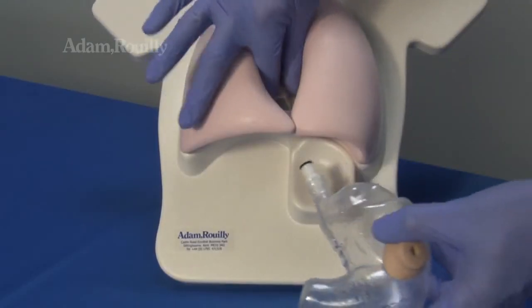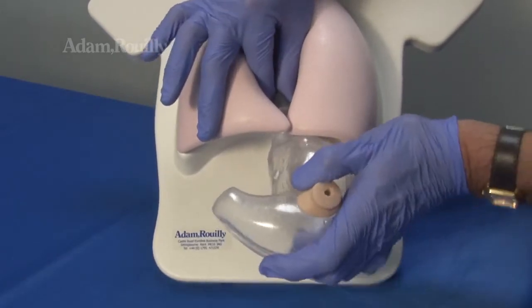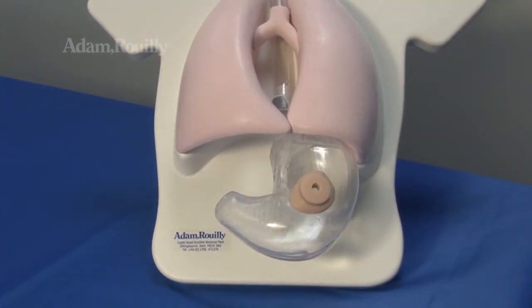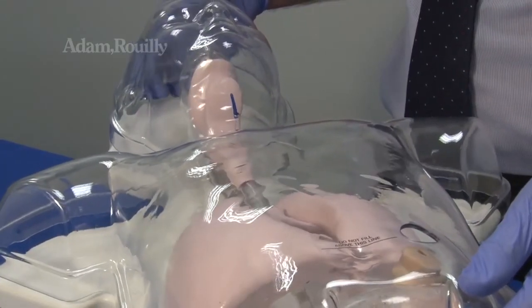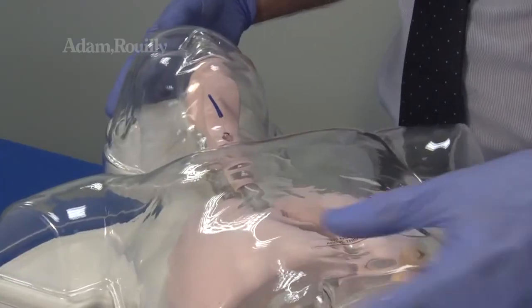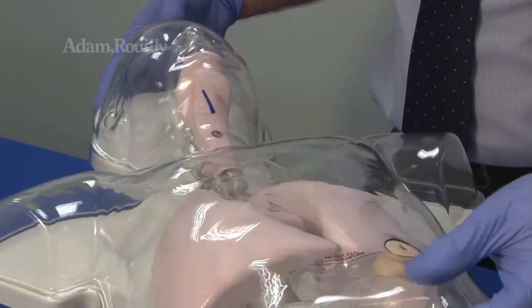To replace the stomach, locate the stomach tube into the connector and push until it clicks into place. Replace the transparent cover, guiding the epiglottis cord and gastrostomy opening.